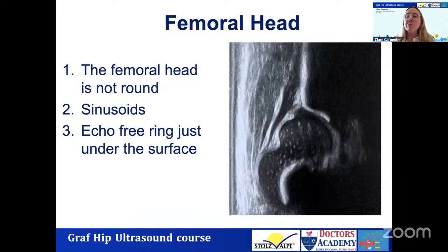But of course, our femoral head is not perfectly round. It's almost like, for want of a description, as we come from Wales, a rugby ball shaped or ovoid in structure. So again, when other types of ultrasound classification look at the percentage cover of the femoral head, if you take an ultrasound that is out of plane, your femoral head coverage is going to be inaccurate. So we don't tend to use femoral head coverage because of the fact the femoral head is not perfectly round.